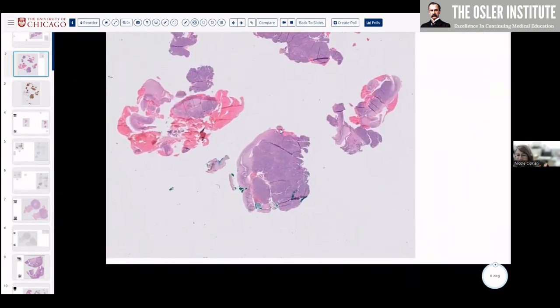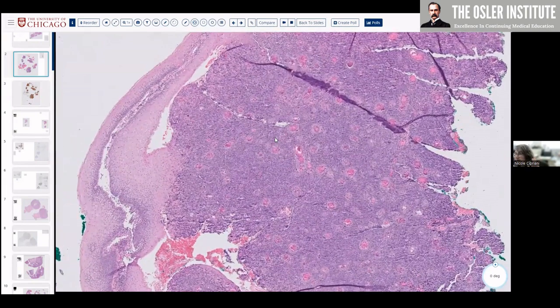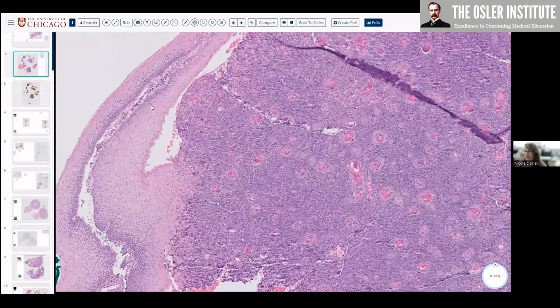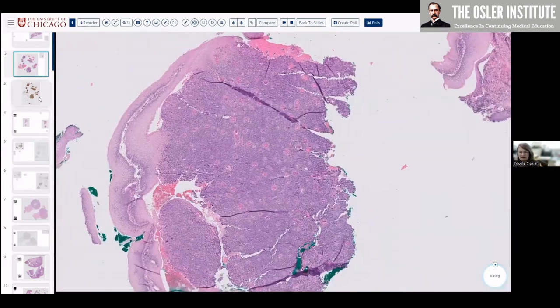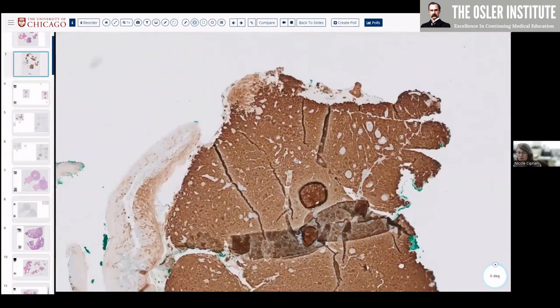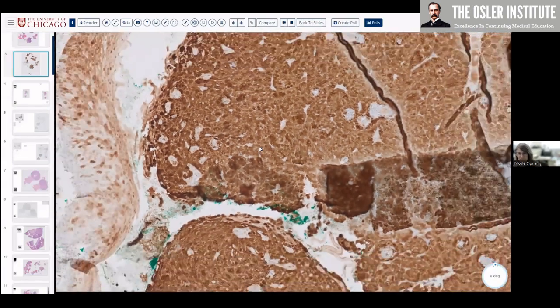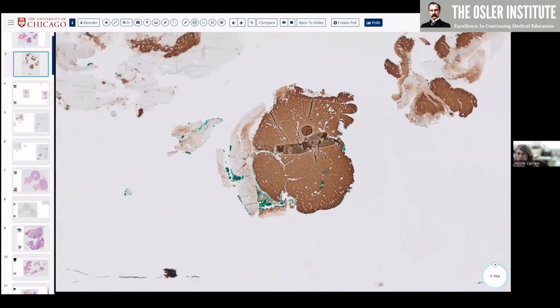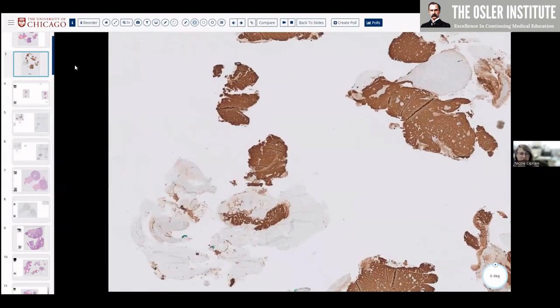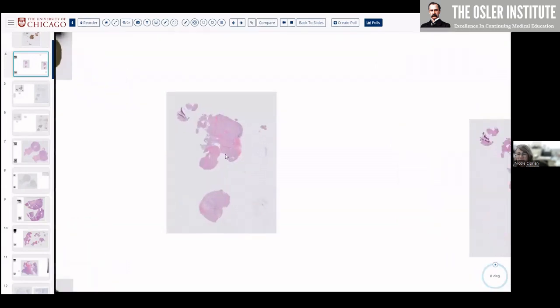So all of these non-keratinizing squamous cell carcinomas of the base of tongue and tonsil should be regarded as invasive, regardless of whether you get a tiny biopsy or a large biopsy, regardless of whether you see adjacent normal epithelium or not. All of these non-keratinizing oropharyngeal cancers are invasive, excellent. And so we do, of course, our favorite surrogate immunomarker, p16, exactly. So diffuse strong staining will be predictive of HPV. And I'm just going to run through these rapidly because we have so many.